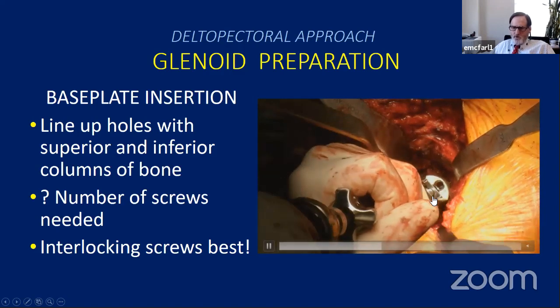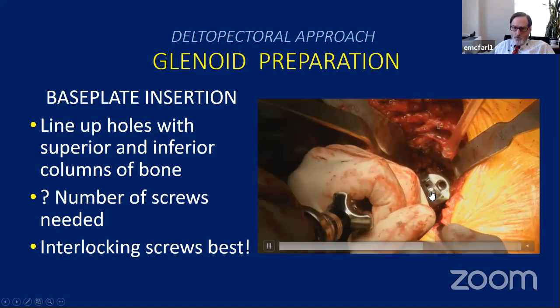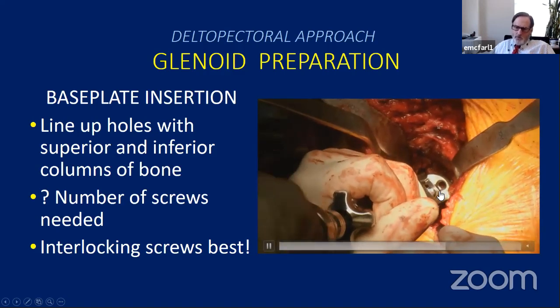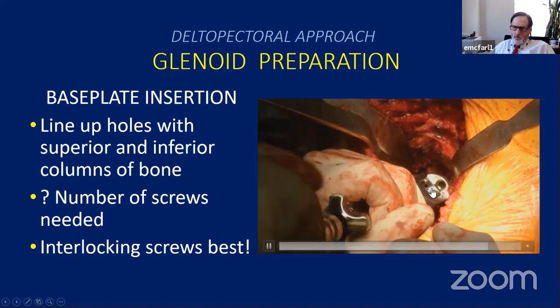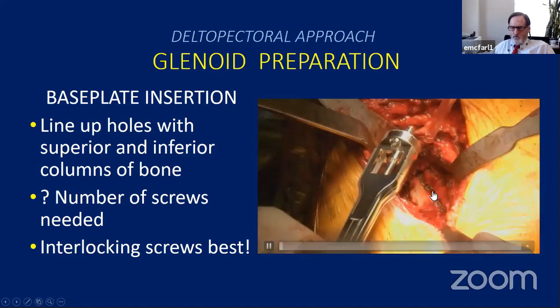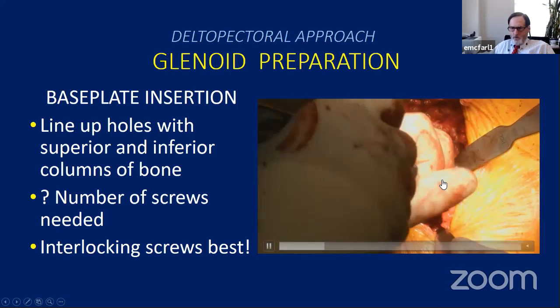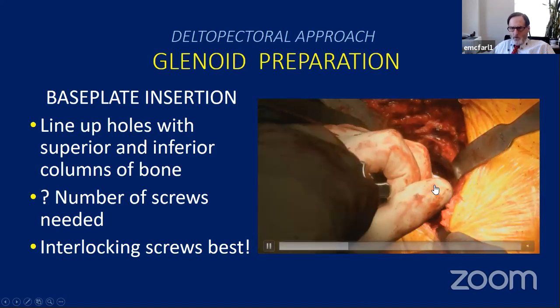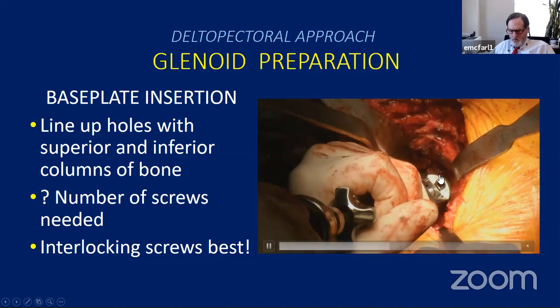Many of these systems have a central peg. I'm not real fond of central pegs unless they have a screw that goes through them. But one thing I will say, sort of anecdotally, level 5 evidence, when you put these central screws in, like say the Frankel system has, this is all monoblock. So you just put it in. The central screws, the fixation is just so fantastic. It blows your mind.